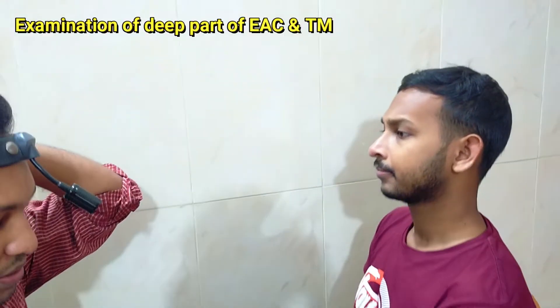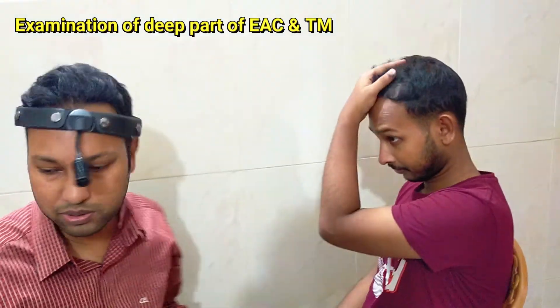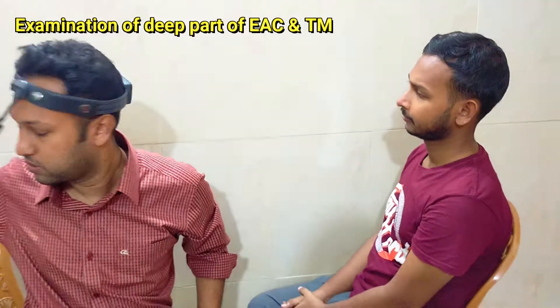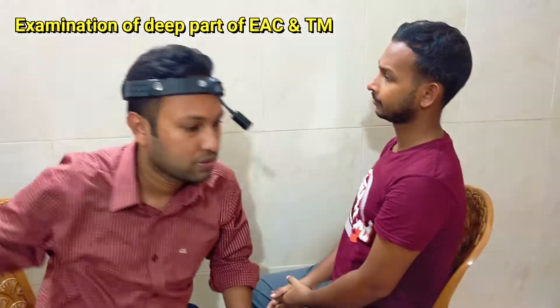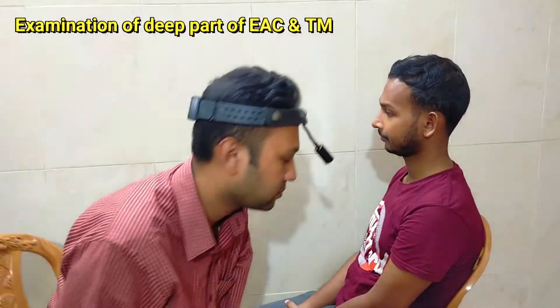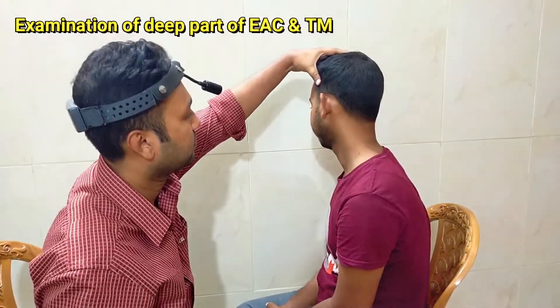Then we have to examine the deep part of the external auditory canal and tympanic membrane. This can be done by aural speculum and otoscope. First, we have to do it by aural speculum.